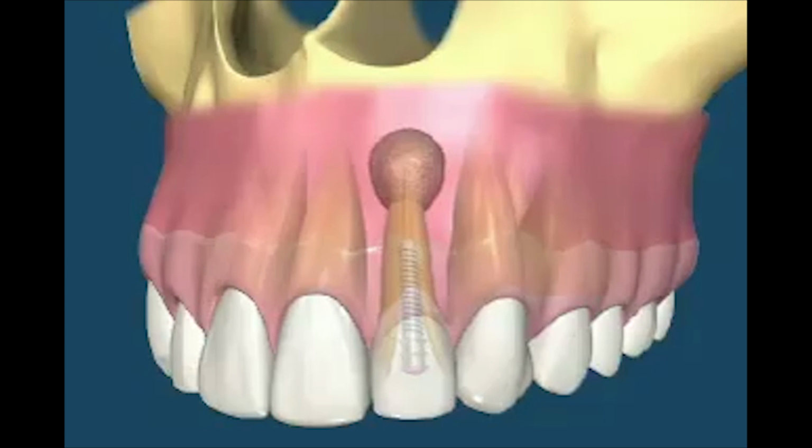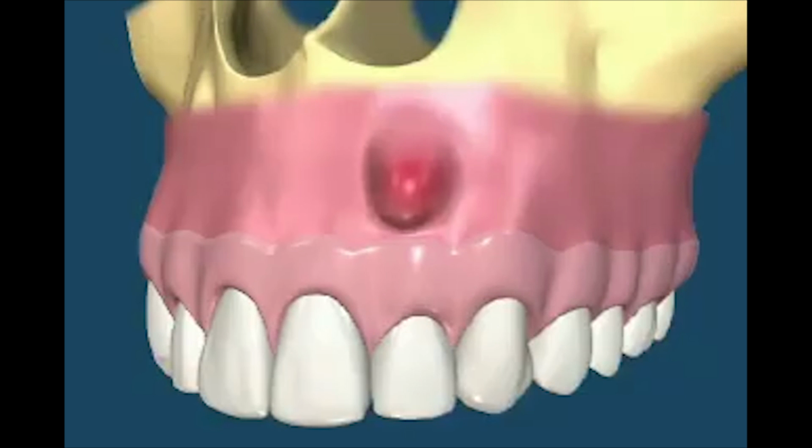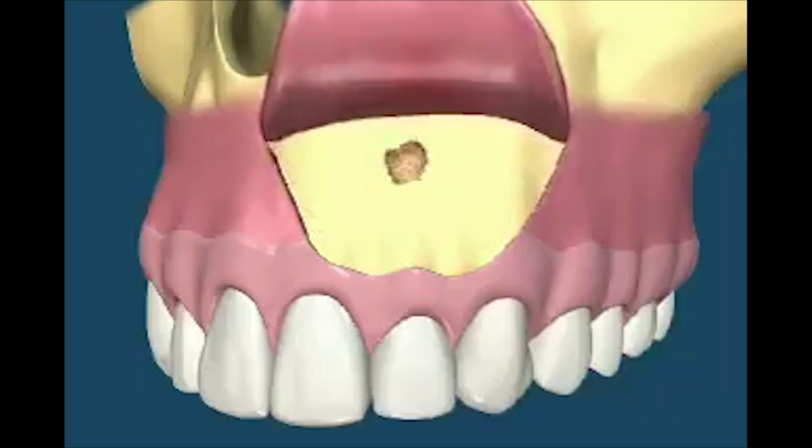However, root canal therapy may not always be successful, and the pathology can continue to grow, accompanied by a sinus-draining swelling in the area. Surgical correction first involves antibiotics to decrease the infection in the area indicated by the green arrows. Then a flap is raised, and some bone is removed over the pathology to provide access.